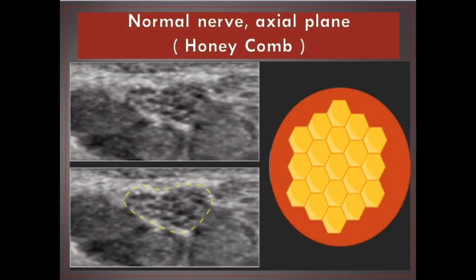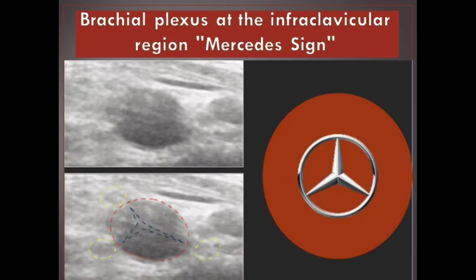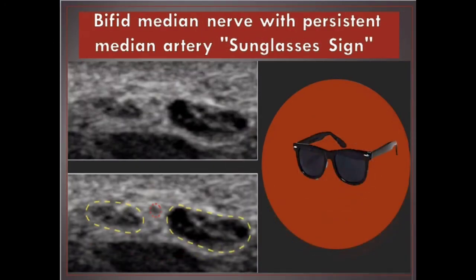Normal nerve, axial plane: honeycomb appearance. Normal nerve, longitudinal plane: rigatoni sign. Brachial plexus at the infraclavicular region: mercedes sign. Bifid median nerve with persistent median artery: sunglasses sign.